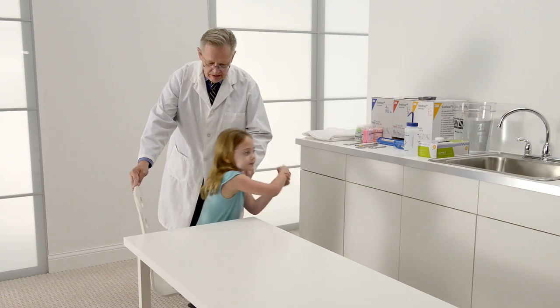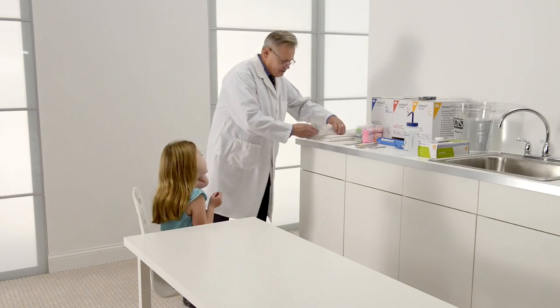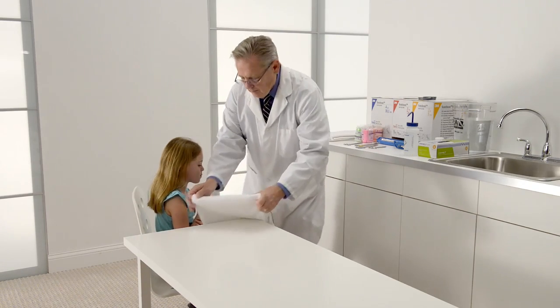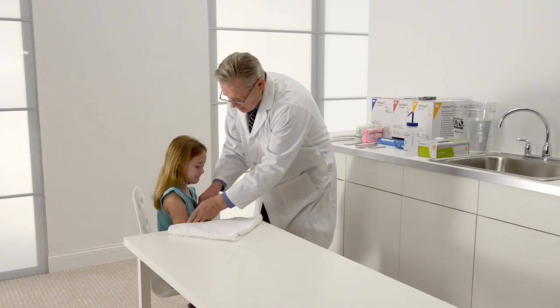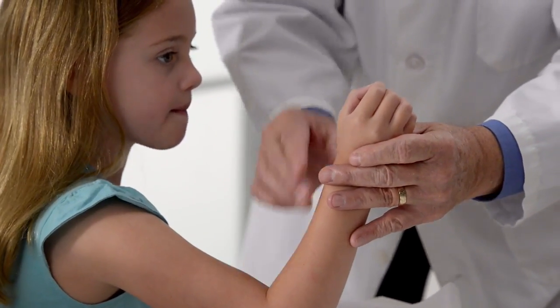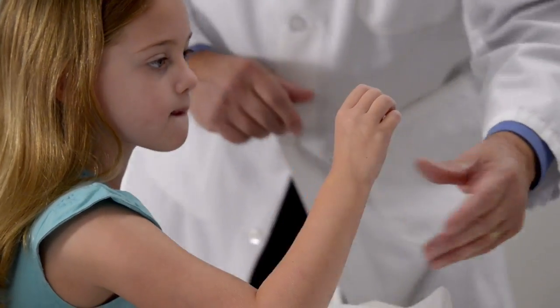Make sure the patient is in a safe and comfortable position, and ensure you're able to easily splint the arm and maintain proper body mechanics. Unless otherwise indicated by the physician, the wrist and hand should be placed in an anatomically neutral position.